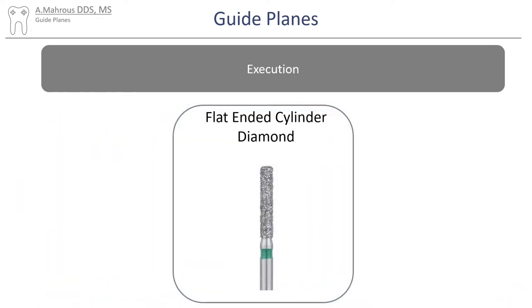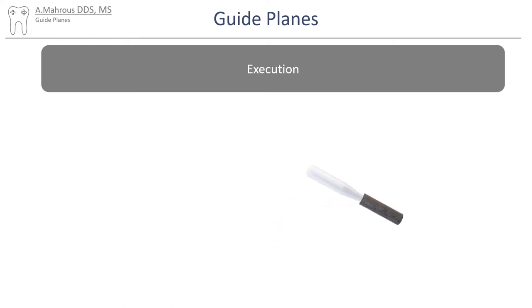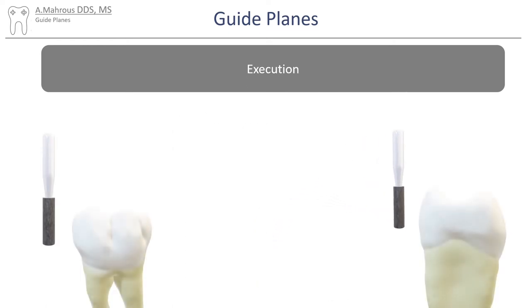You'll need the flat-ended cylinder diamond for this. After careful evaluation of the planned path of draw, the diamond is brought close to the tooth in a direction parallel as possible to the planned path on the surveyor.